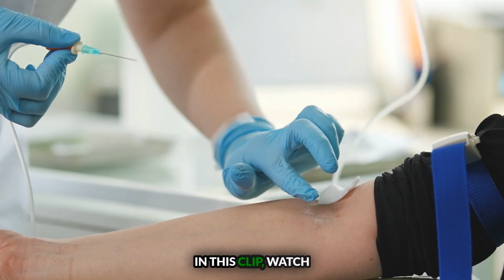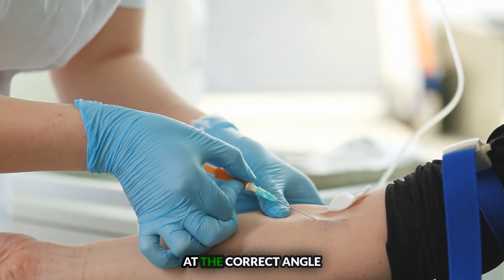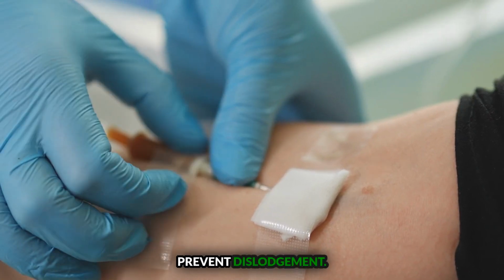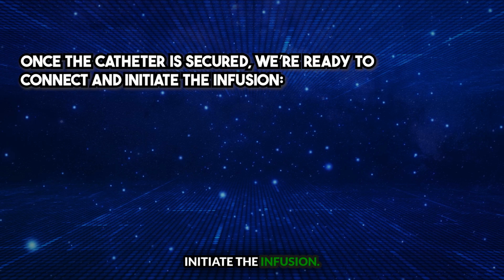In this clip, watch how the clinician identifies a suitable vein, inserts the catheter at the correct angle, and secures it to maintain sterility and prevent dislodgement. Once the catheter is secured, we're ready to connect and initiate the infusion.